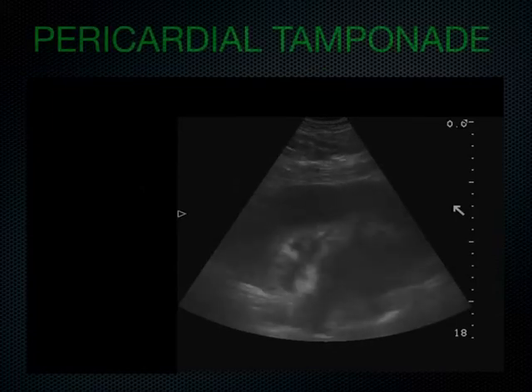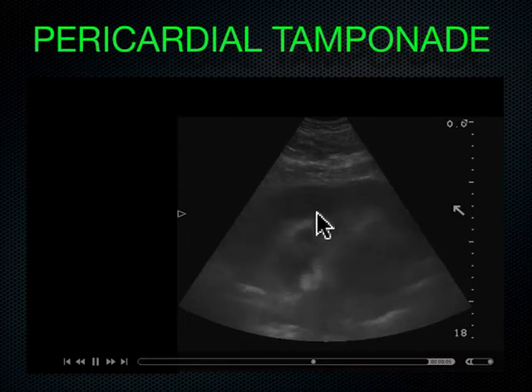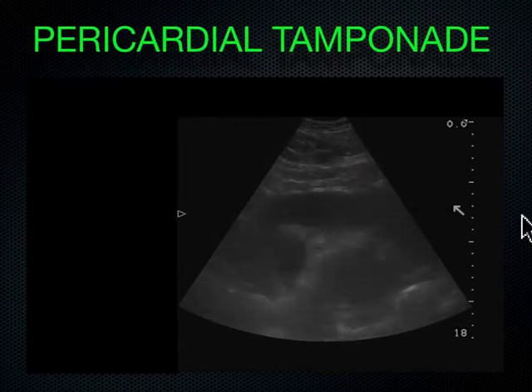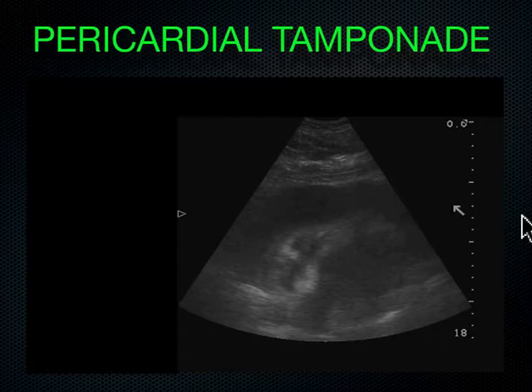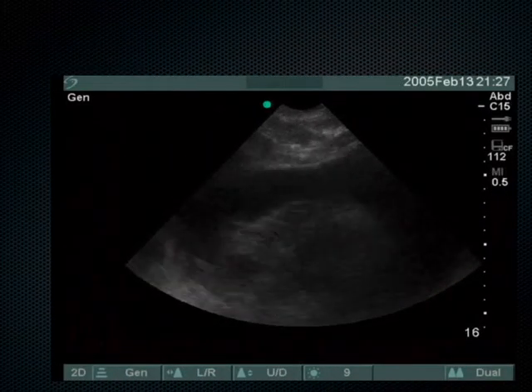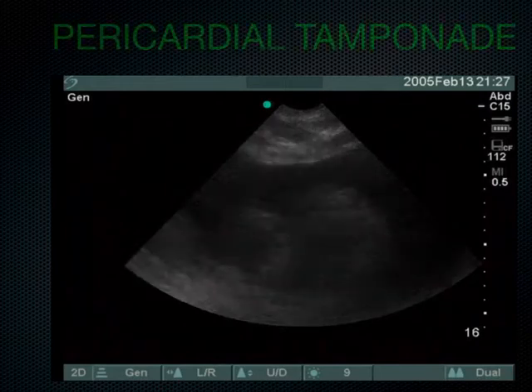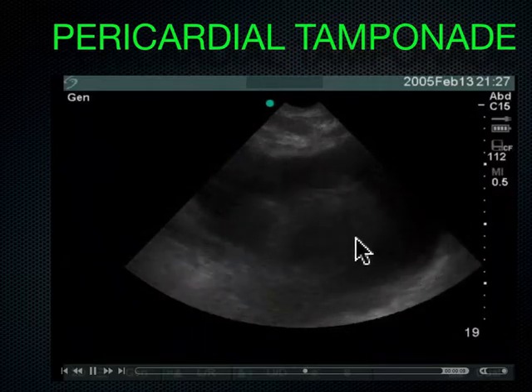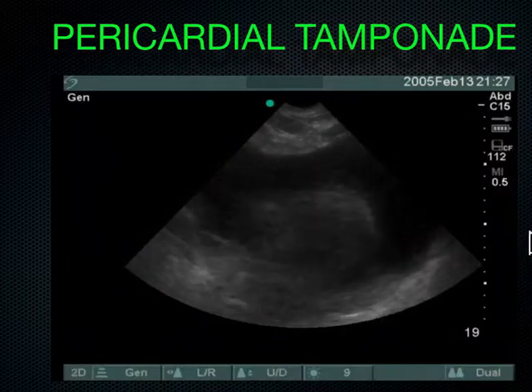This is an example here of the tamponade. Notice again, it's this jumping up and down trampoline effect that's easy to see on the screen to say that there's diastolic collapse. It's just another example here of a pericardial effusion that the heart is swinging around in that pericardium. That also kind of hard to tell whether there's jumping up and down here or not. What else do I do to differentiate pericardial effusion from pericardial tamponade?